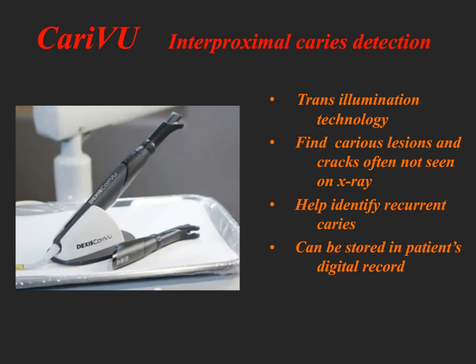And actually, as a digital image, this can be stored in the patient's digital record. Being that it's a digital record, it could also be used for insurance documentation, something that you can back up your X-ray and clinical photography with when creating records for your treatment.